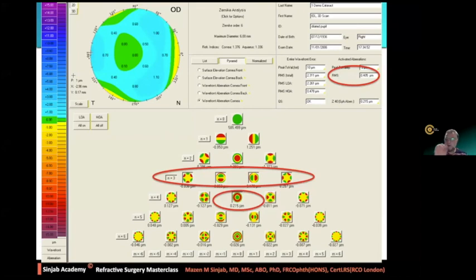If you don't click these on and all others are off, then the RMS will represent what's on, all right? So in many cases, when some friends send me some of these to study, I find that all of them is on. So I cannot study. We have to click on only these 5 higher order aberrations.